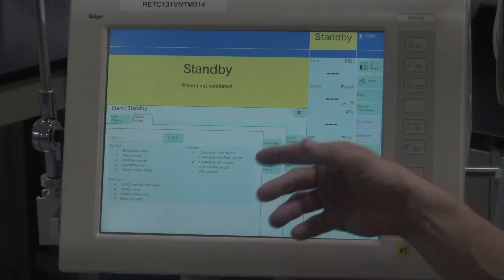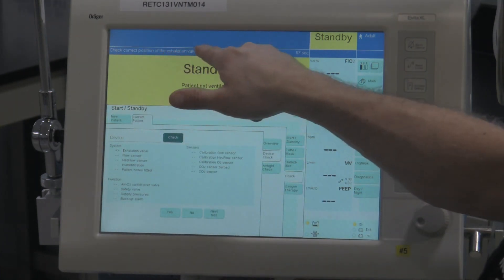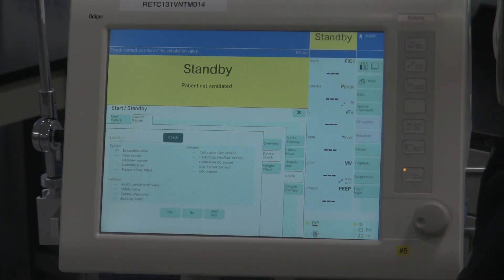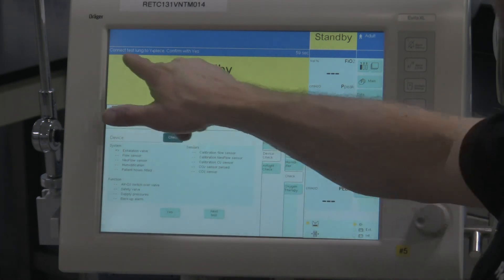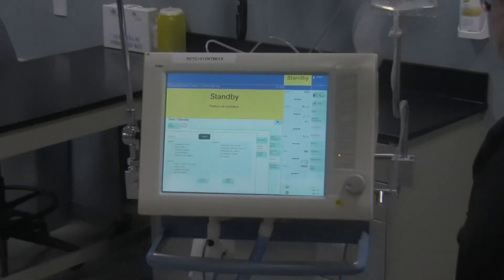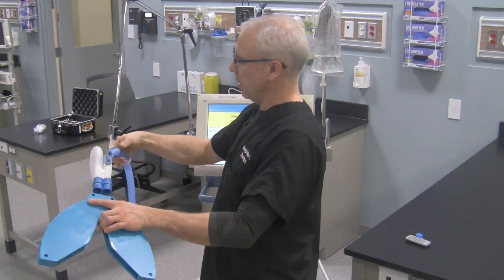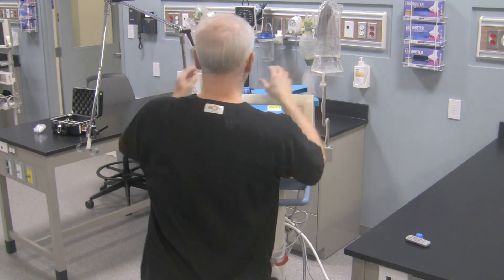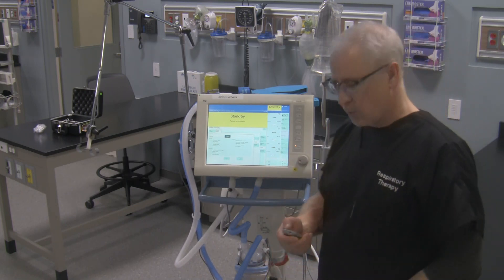The first thing you need to do to start the check is to touch this tab right here that says 'Check.' Now it says 'Check the correct position of the exhalation valve.' The exhalation valve is just underneath the ventilator right over here. It seems to be in its right spot and configured properly, so we're going to hit the tab that says 'Yes.' Now it says 'Connect the test lung to the Y piece, confirm with Yes.' So I'm going to take the test lung, connect it up right over here, take the circuit off the support, and simply place the test lung on top of the ventilator.